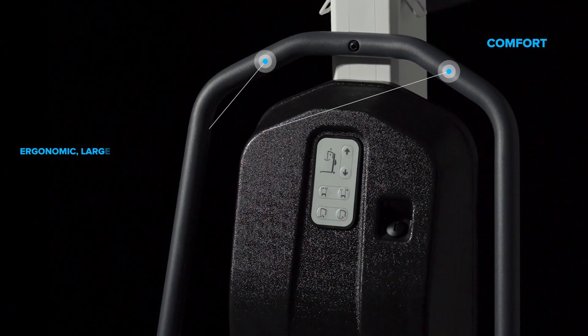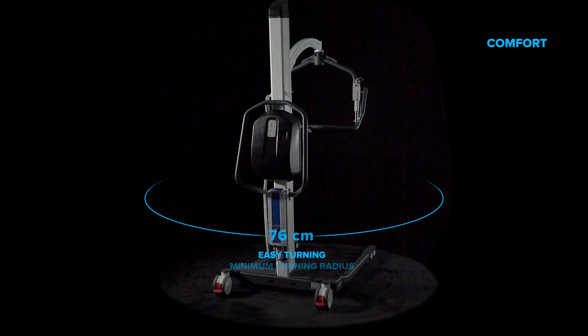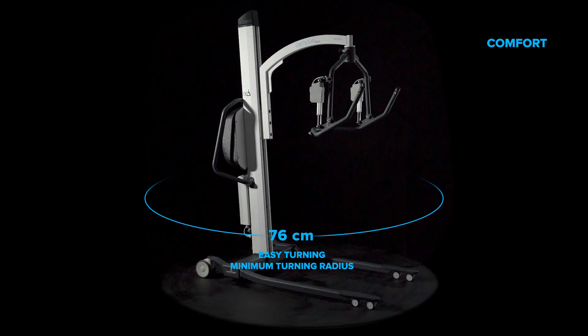Ergonomic large-grip handles facilitate patient transport. Minimum turning radius: 76 cm.